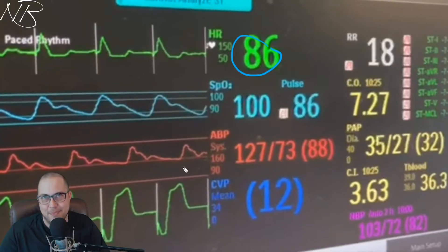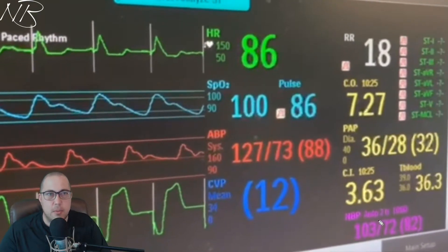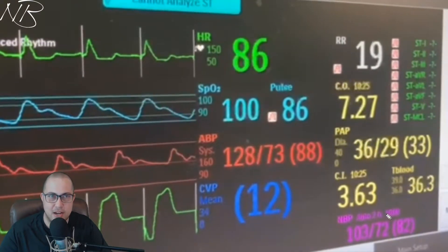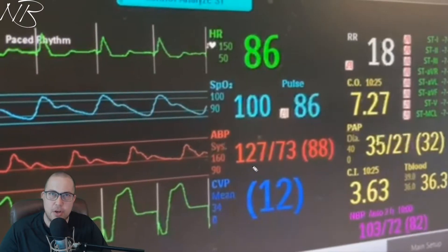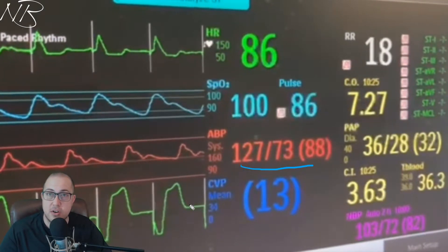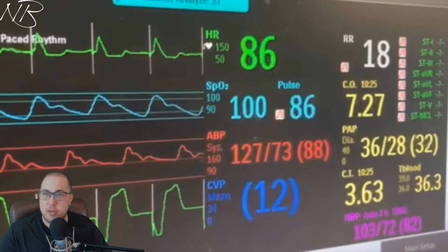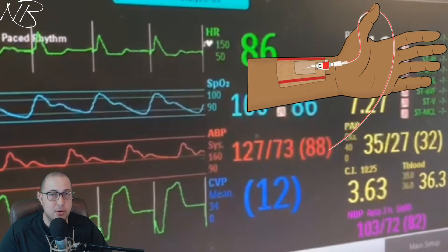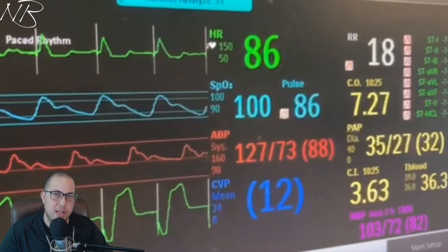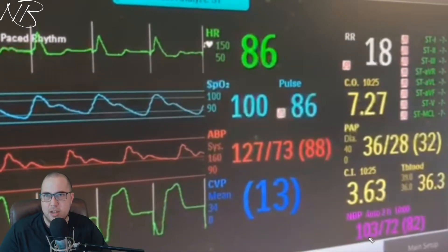We have a heart rate of 86 beats per minute and SpO2 satting at 100%. Down in the bottom right-hand corner we have the normal typical blood pressure taken via a cuff, cycling every two hours — that's our cuff pressure. We also have an arterial blood pressure given to us through an invasive intra-arterial line, providing a second-by-second reading of this patient's blood pressure. This can be a radial, brachial, or femoral artery line, and it's much more accurate and reliable than a cuff pressure.